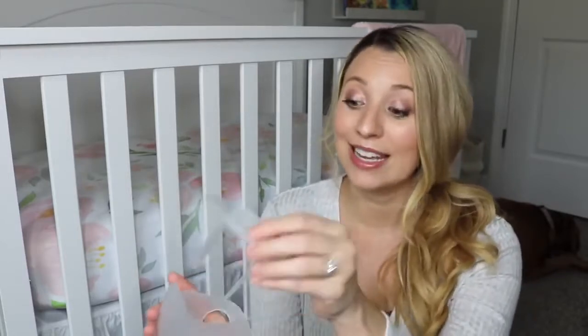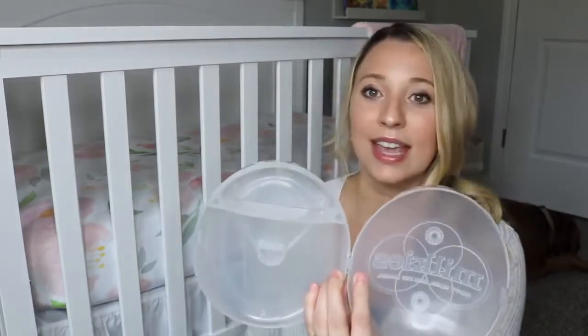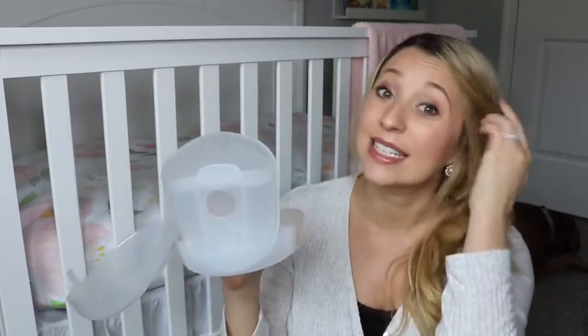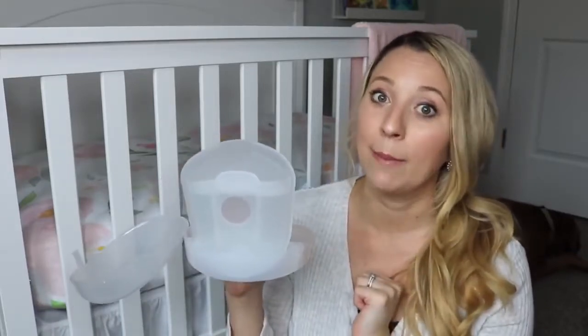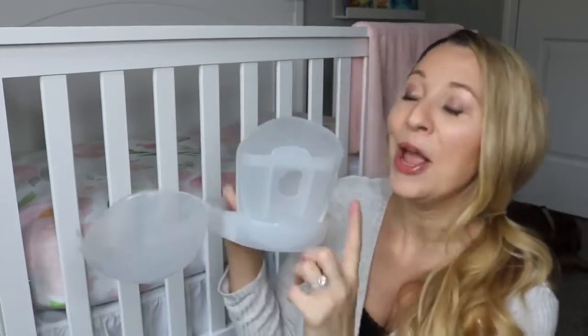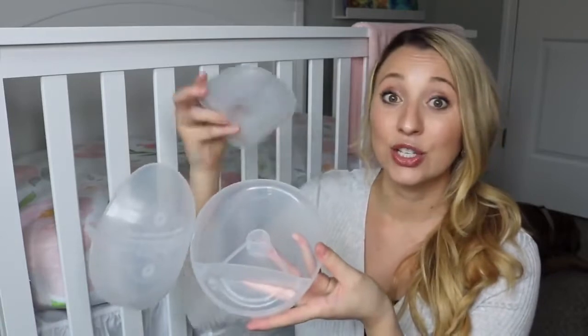This comes in super handy as well. It also comes with a case to keep it nice and clean, which is good because dog hair definitely sticks to silicone if you don't keep it protected — and you guys know how much Chip sheds. This is what the case looks like, and this part right here is actually to help your Milkies Milk Saver stand up so that it doesn't spill, because I have spilled it a couple of times — I did cry over spilled milk. But this is really helpful because it keeps it standing up so that your milk doesn't spill. And then afterwards, you just use this to store your pieces.